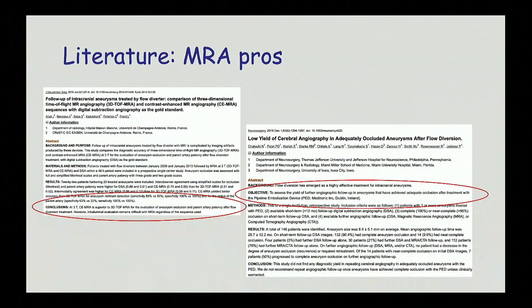So some people will say that it's better to do only MR. I think not exactly, and usually the DSA is considered to be the gold standard of follow-up of treatment of flow diverter, for example. In this series, you see that DSA is a gold standard.